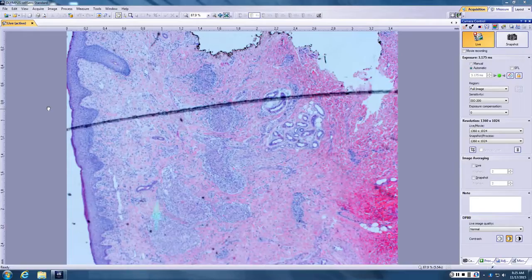Okay, so we've done that, and then some of these, though, are rounder, higher up, not around neurovascular bundles. So what other granulomatous disease? Are these naked or are these dressed? And remember, I was taught dermapath by Southerners, so it's naked. Right, so are these naked or are these dressed granulomas? I mean, they have some lymphocytes, but I feel like I'd still put them in the naked category because there's not really a robust infiltrate. But you said they have lymphocytes. Mm-hmm. That makes them dressed. Scantily clad, yes.